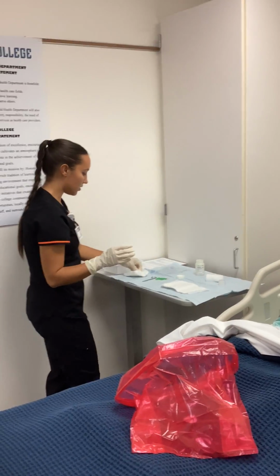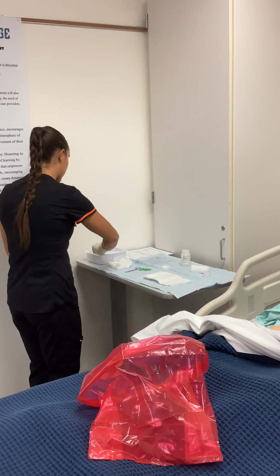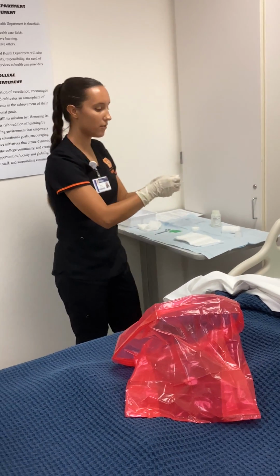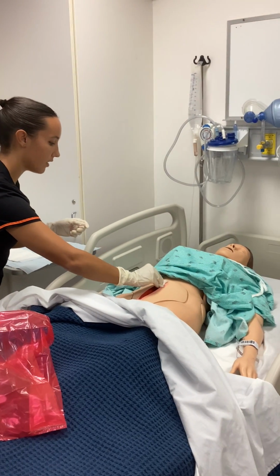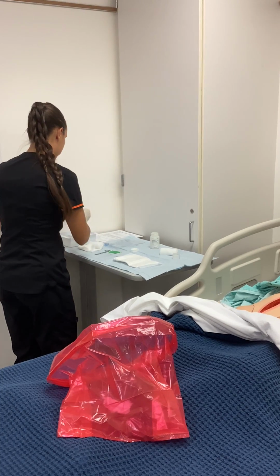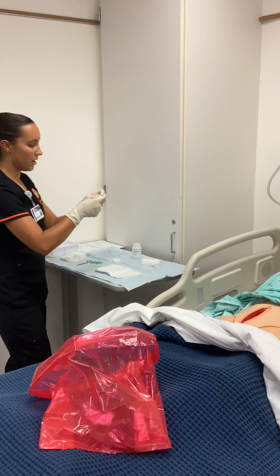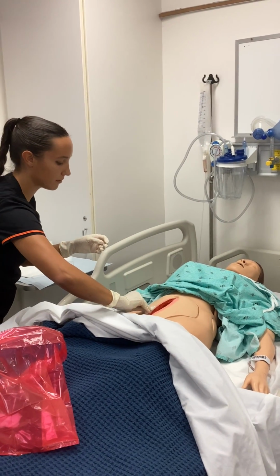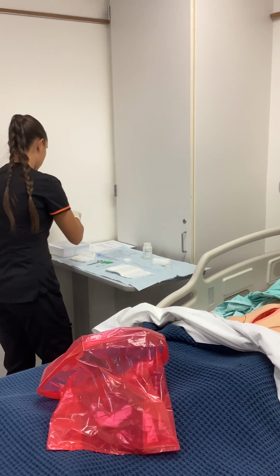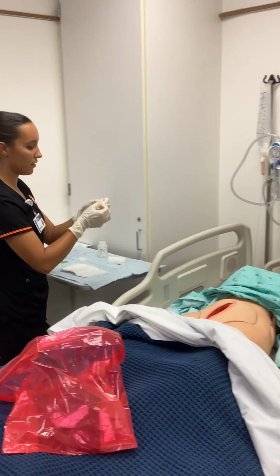Okay, now I'm going to get my gauze. I'm gonna use 1 piece per swipe. So I'm gonna get this wet, and then I'm going to clean from top to bottom. So I'm gonna clean this, and I'm gonna throw that away. Then I'm gonna get a new one. And I'm gonna clean from top to bottom. Throw it away. Get a new one. Clean from top to bottom.